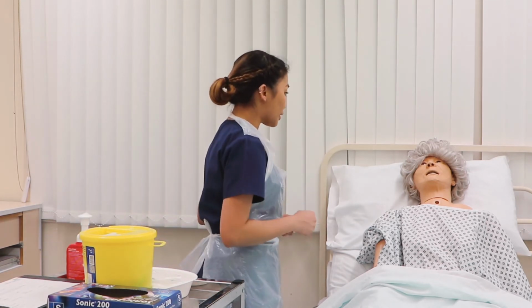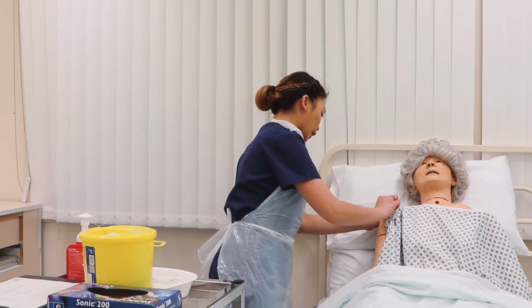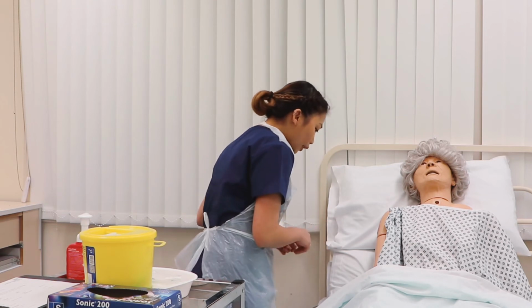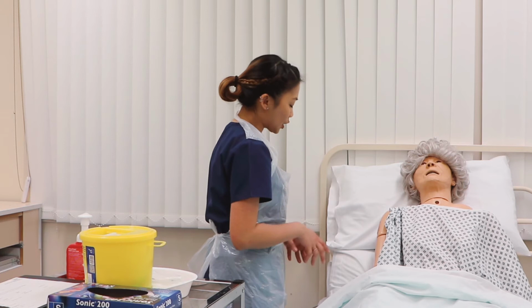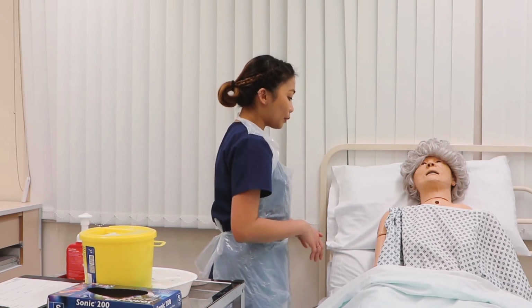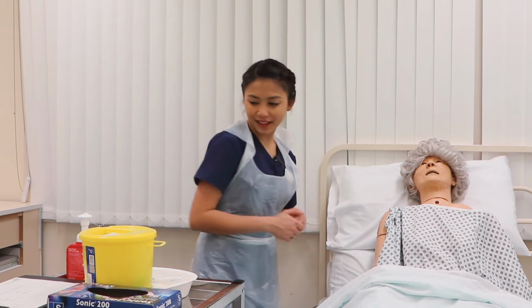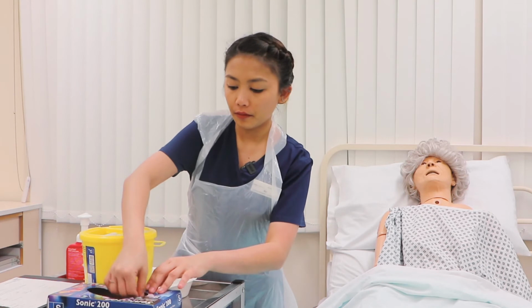Can I roll up your sleeves? So I will inject it on your right upper outer arm. And then I'm checking now if there are any signs of inflammation, edema, infection, and skin lesion. I can see there are none. So it's safe for me to inject on that side. Are you comfortable? Alright, that's good. I'm going to don my gloves.